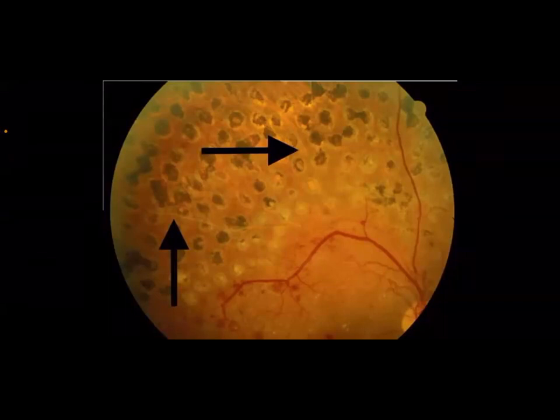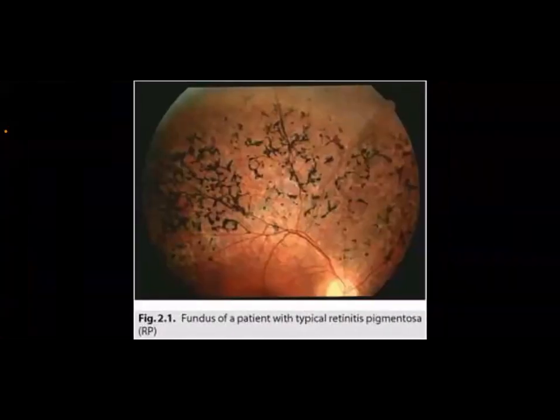So this patient has got retinitis pigmentosa. What to expect to see in the ophthalmoscopic examination? This one. You will find dark, bony spicules, black in color, scattered, especially throughout the peripheral retina. This seems to be extensive because it's affecting a little bit even the macula. There are bony spicules.